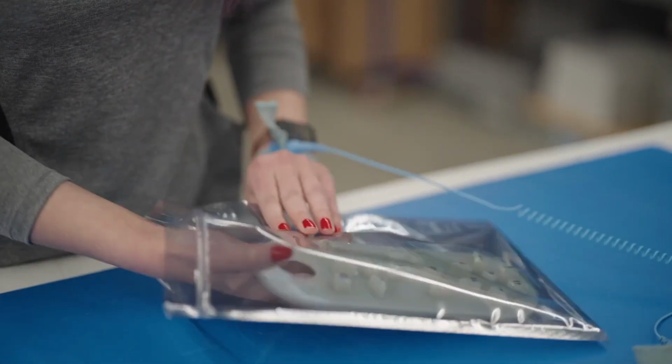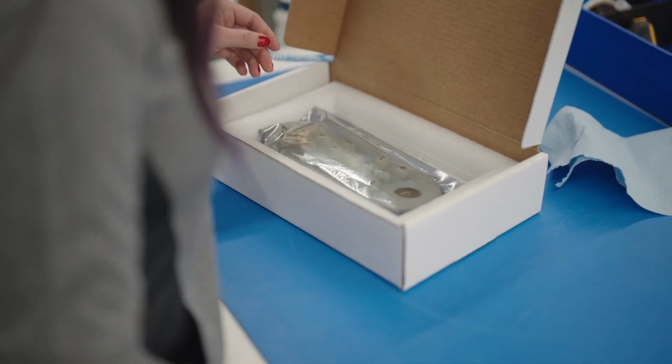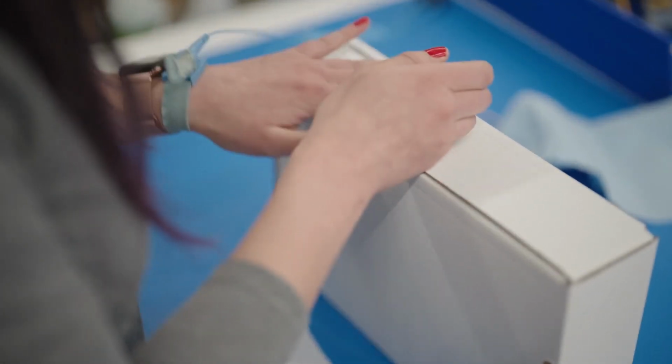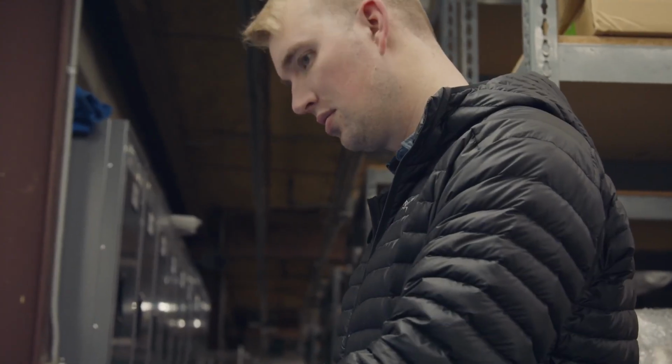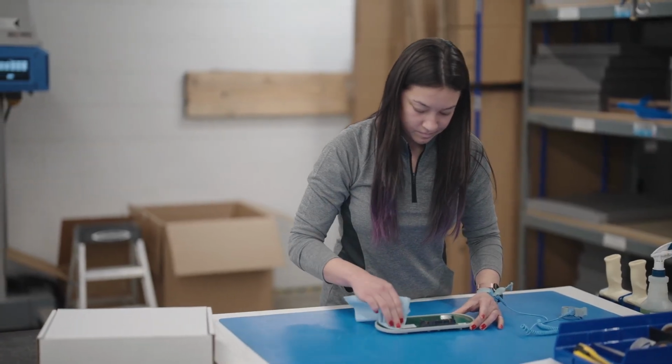If a part is ESD sensitive, it's already in a static bag, so it'll stay in that static bag once it goes into the box, and that also acts as like a vapor barrier for any dust or moisture that could possibly damage the part on the way. We give it the final visual inspection, we give it the final wipe down, and then we also take photos of all the parts. Part of the process to photo this is to hold ourselves accountable, so that way if there are any issues or any places that we can get better in packaging, we can go back on these photos and look and say, hey, maybe this is an area we need to get better in.